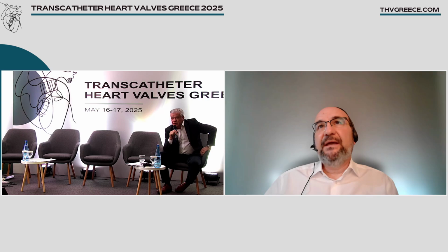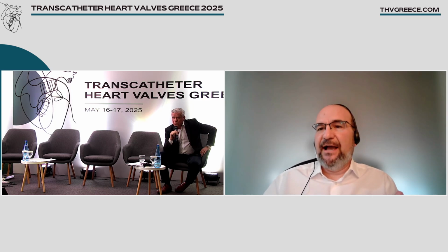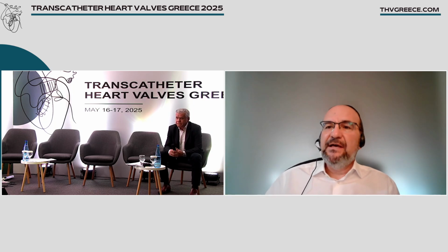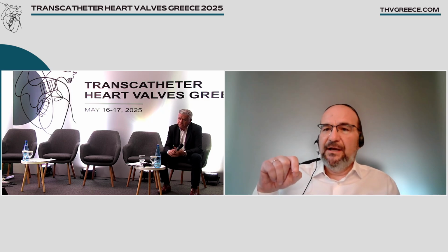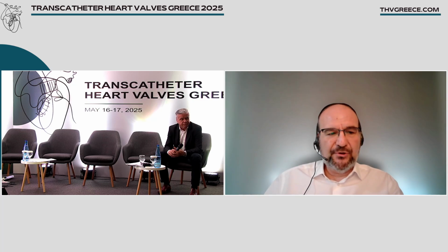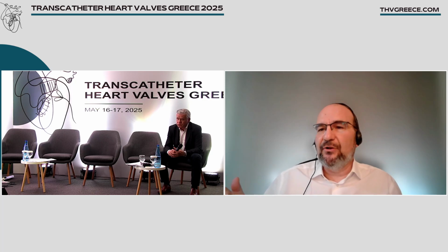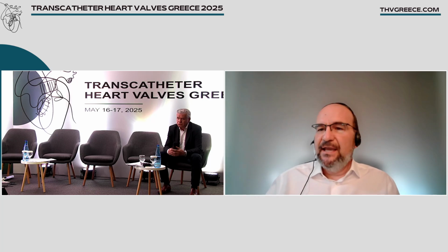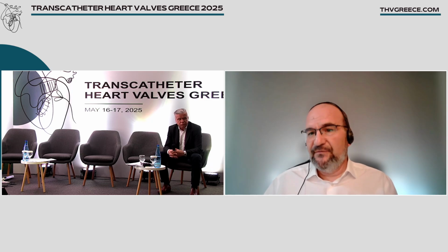Well, generally speaking, I think it's the protection of the coronaries. Yesterday I did a case again with an Evolut valve where, to my surprise, the two leaflets were torn after 4 years. It could be product failure. But this patient had a previous CABG, so I was not concerned at all. I put my valve where I had to put it, I had an excellent result, and I didn't mind about the coronaries. It was about a 10 minute job. But when you have to protect the coronaries, it's a different issue.